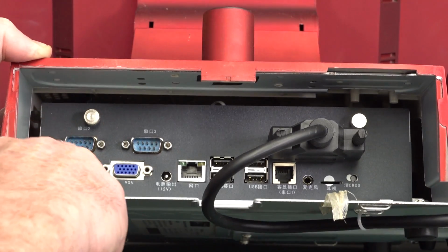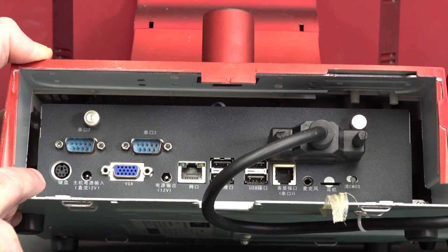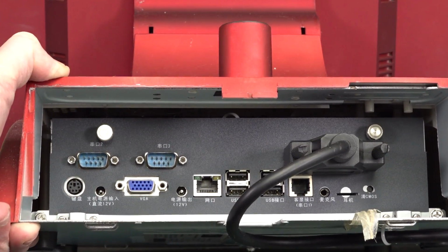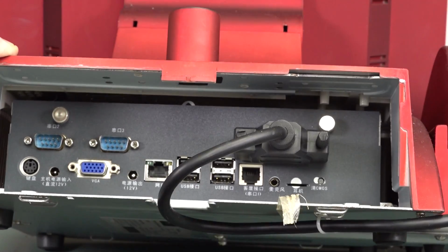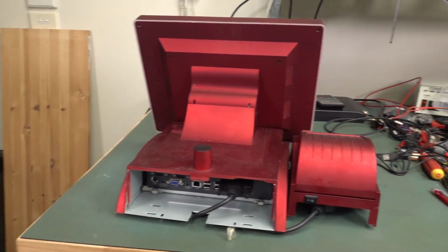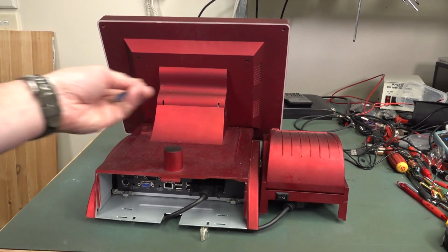These are different sizes, though. These are two different size pins inside there. So that's interesting. I might see if I can feed 12 volts up its clacker and try it out. Little micro SD card over there, and a custom printer interface, but it's obviously some sort of customized skin check machine. Inside it's probably just some little customized PC that, interestingly, runs from 12 volts. So I won't tear down the monitor or the printer or anything like that.